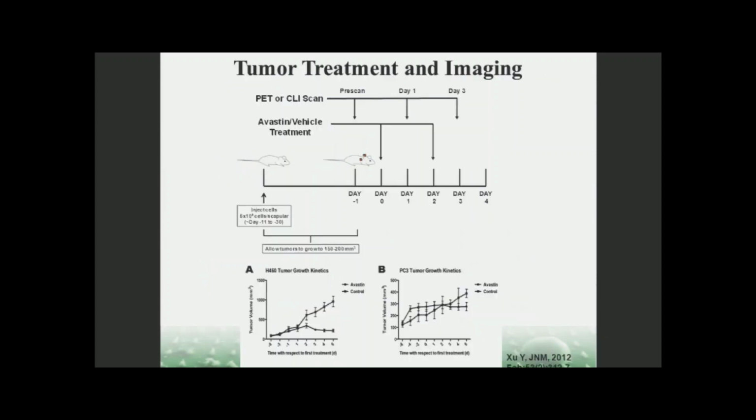And to me, I think for preclinical research, Cerenkov Luminescence imaging is especially important for drug development, for monitoring tumor treatment. So here we show one example. We wanted to verify whether Cerenkov Luminescence can give similar information as PET imaging when we use it for drug therapy monitoring.